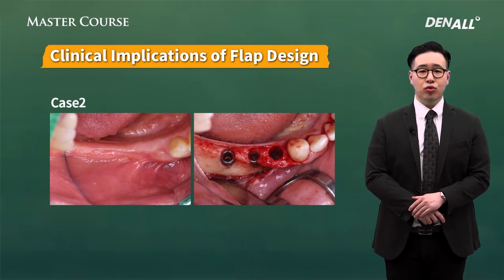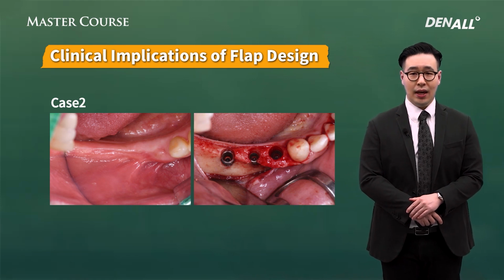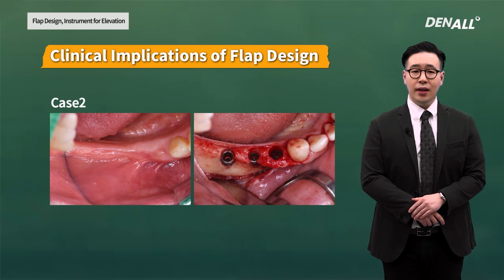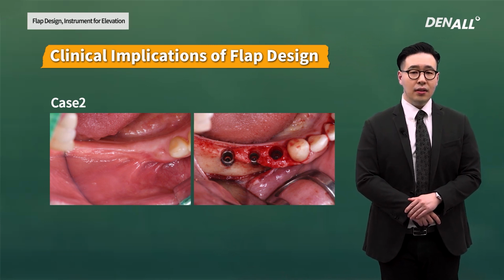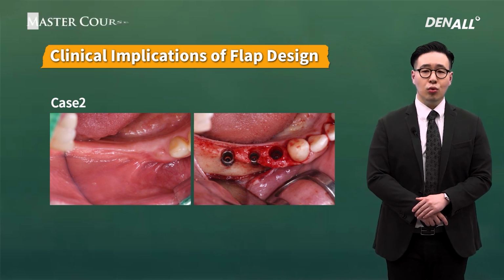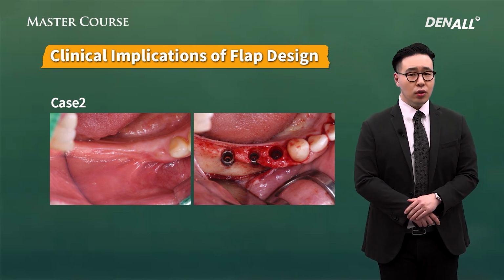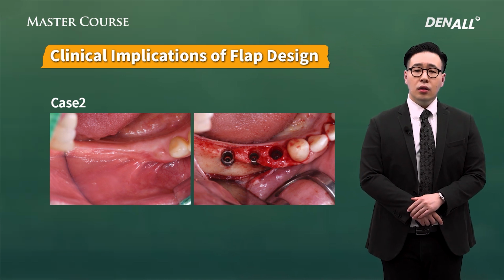And before you make the incision, you need to analyze a couple of important factors with CBCT analysis. First, whether you're going to do bone graft only or place the implant together. Second, implant placement position. Third, you need to understand where the mental nerve is, which is a very important anatomical structure. With the analysis, design your flap and the alveolar crest incision.